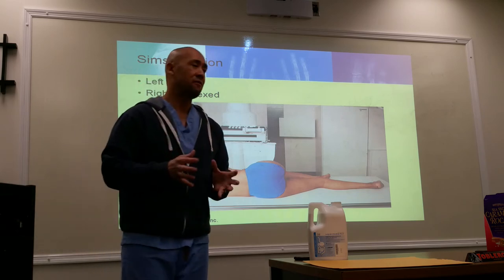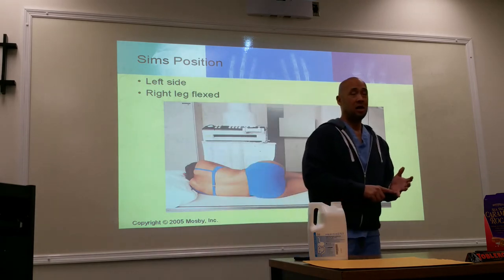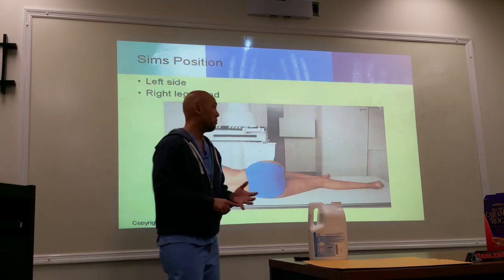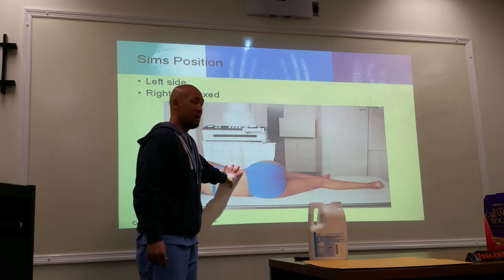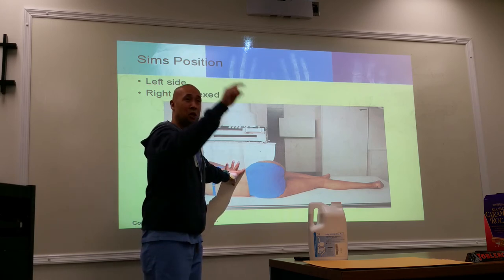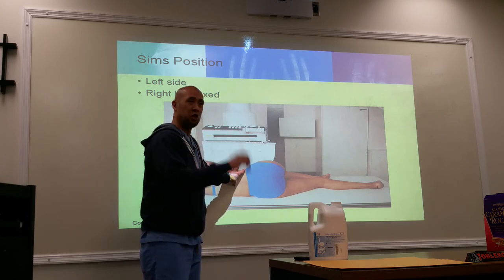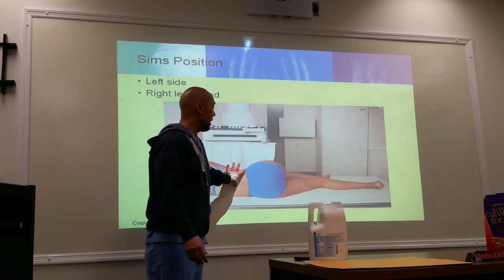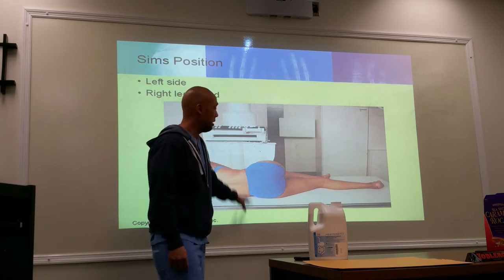Also, be mindful not only of gender, but also of age, because age can also play a factor. If it's a female, you may get a female technologist to put the tip in. With an older female, remember what I said, sometimes they don't even care. But if it's a younger female, you want to get a female to put the tip in. Males usually don't have a preference. But gender and age do play a role in tipping the patient.